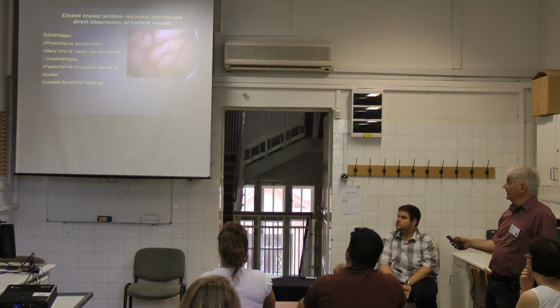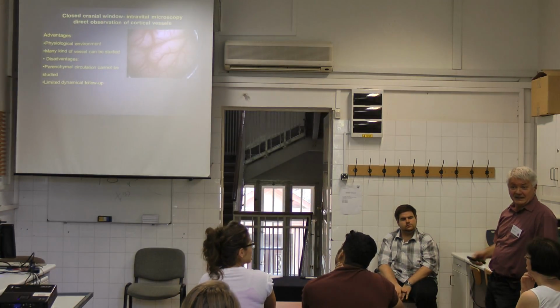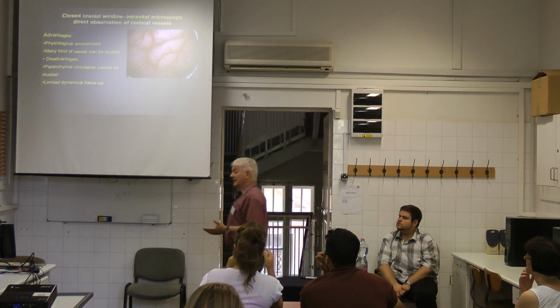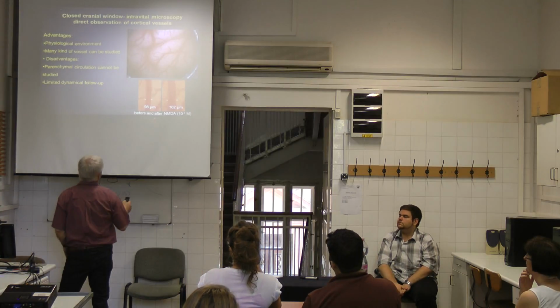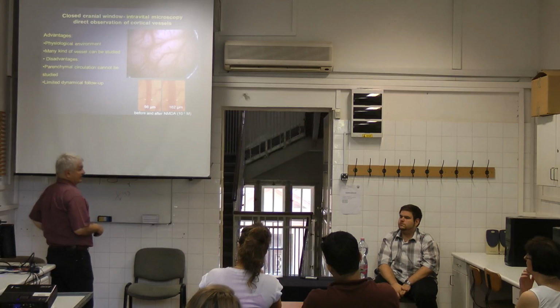You see only the surface. You cannot have any idea what is going on inside the brain. So if you illuminate with a laser light, you can penetrate as deep as 1 millimeter or so. And so these are the major changes, the diameter changes.